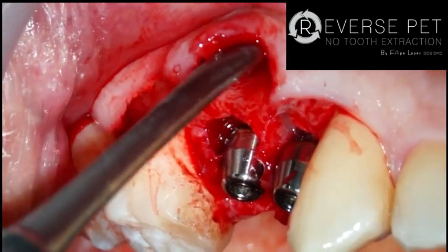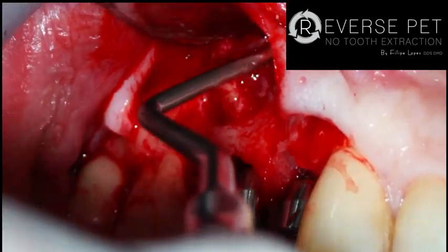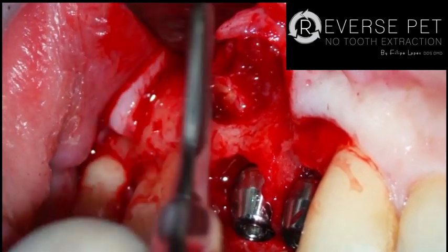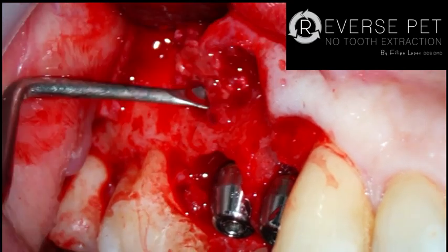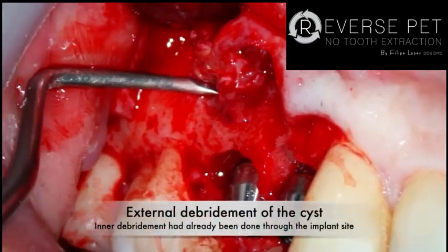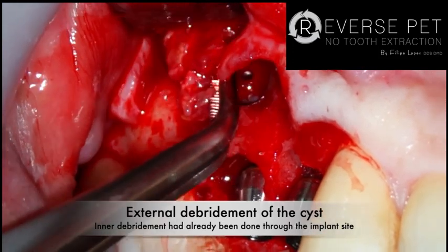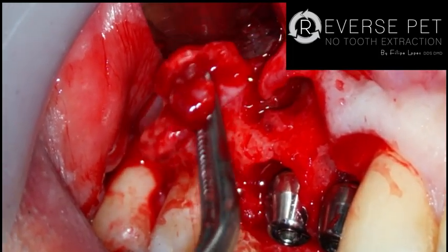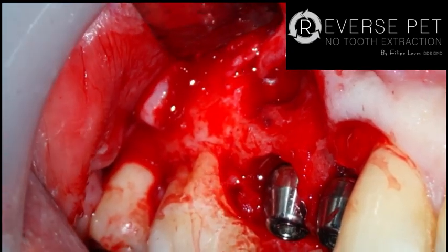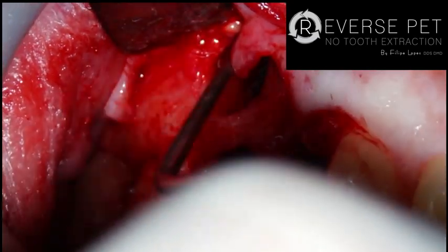And now you get to see what is underneath, okay? So I had debrided part of the cyst on the alveolar axis while I was prepping the site, the implant site, with the small round burrs. You didn't get the chance to see it, but now I'm doing the external debridement with a direct access to the cyst.